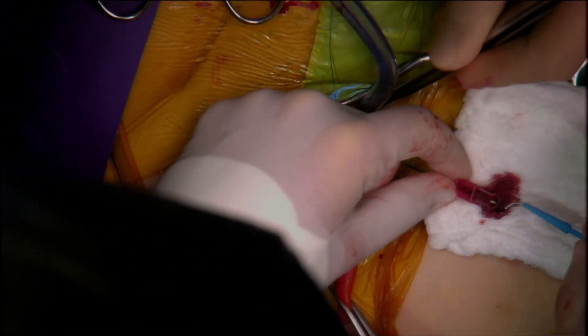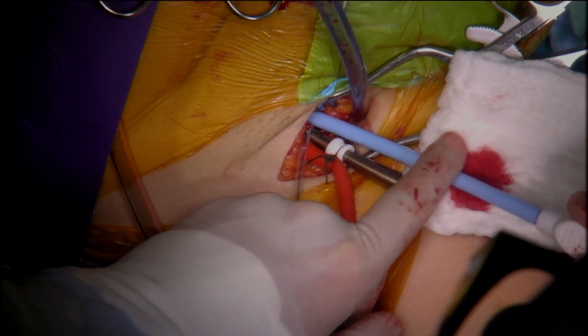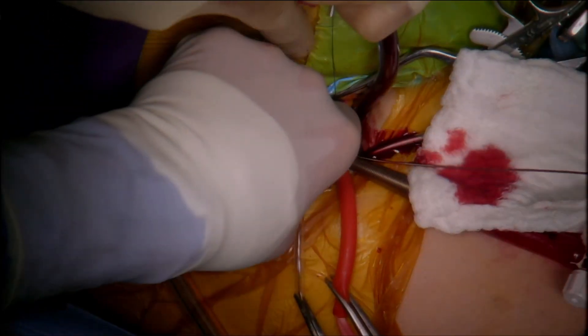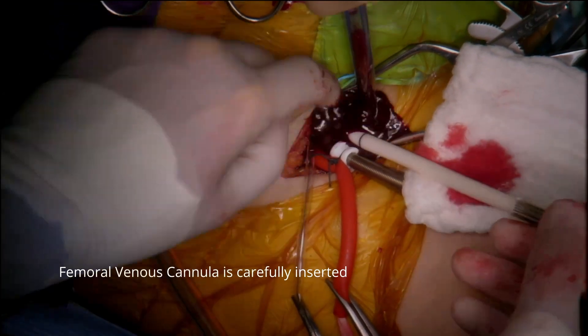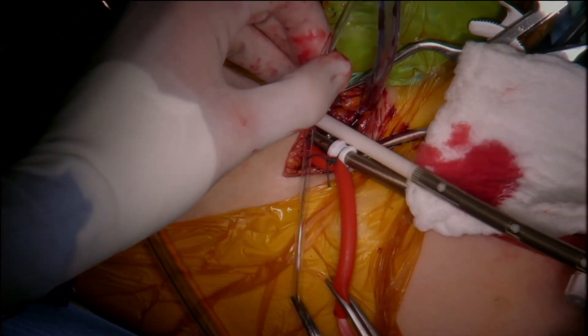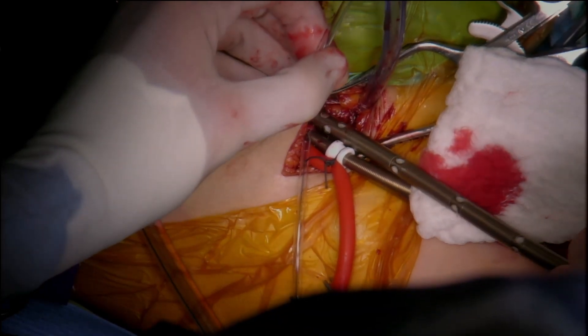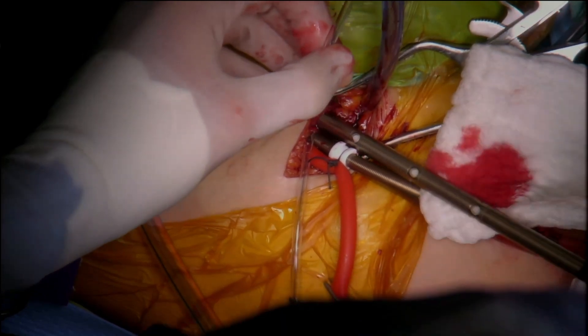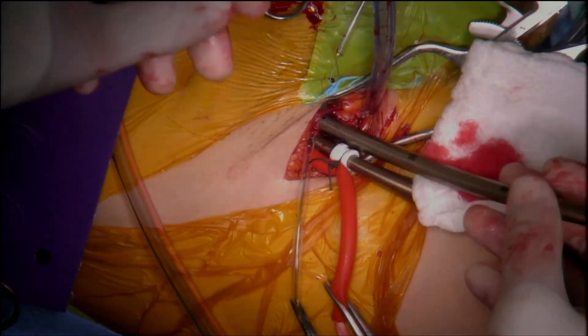A purse-string suture is placed and a needle is inserted to pass a guide wire that will lead the cannula into the right atrium. The vessel is then dilated and the femoral cannula is inserted. When the cannula is carefully inserted into the vessel, a tourniquet secures the purse-string suture around the cannula and it is ready to be connected to the perfusion circuit.